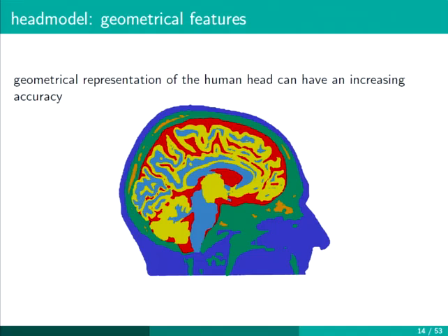And as to the second question, it is a good question. There's a big debate on that. There are some parameters which are considered to be fixed, but we don't have in vivo measurements. There were some measurements of conductivity in dead bodies, but it was proven that the conductivity values drop immediately after death, so it's not really reliable. EIT is also not a good instrument to detect the conductivity of tissues.